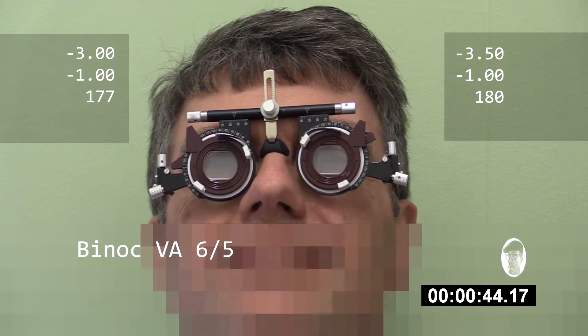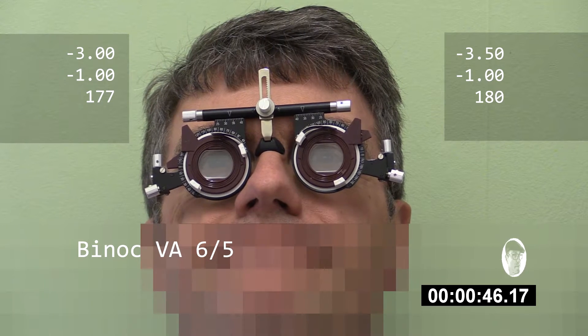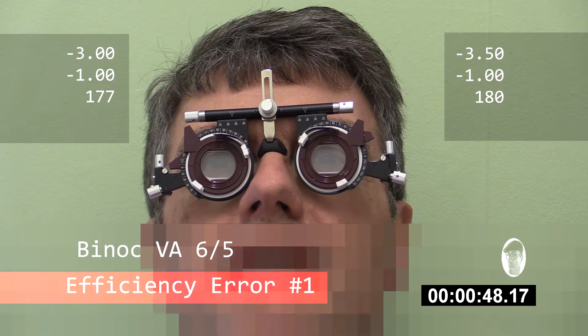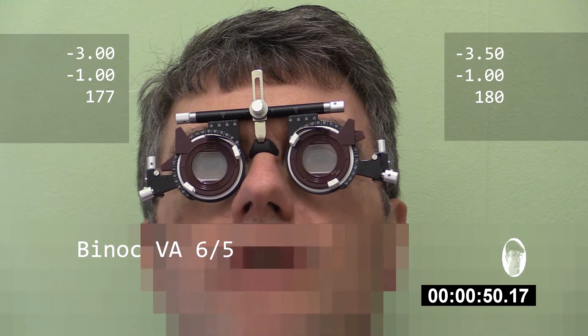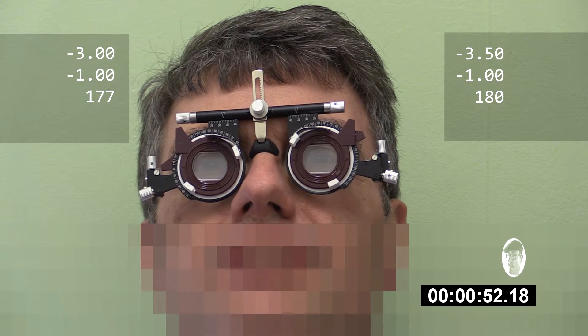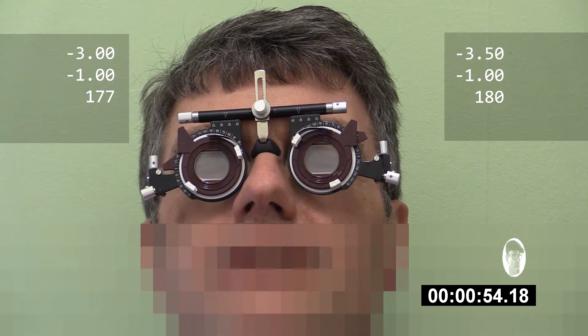What's the smallest line that you can see there? Maybe A, U, T, H, Y, something, X, V, something like that. Okay, perfect.